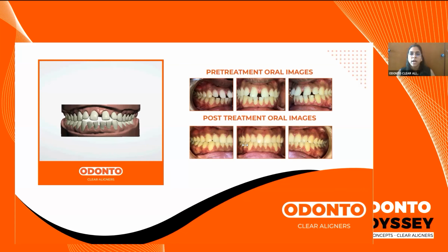So if you have a plan in hand wherein you have a 0.3 mm program, or you have 0.4 or 0.5 mm proximal reduction which is to be performed, then you have to use the corresponding burr for the same. If you have 0.3 mm, then you use a 0.3 mm burr in that particular region. If you have 0.4, you use a 0.4 mm in that contact, and 0.5 you use accordingly. So you can start off with those.